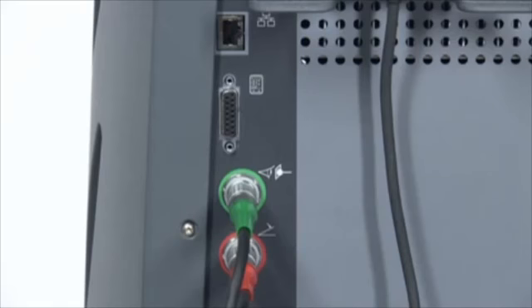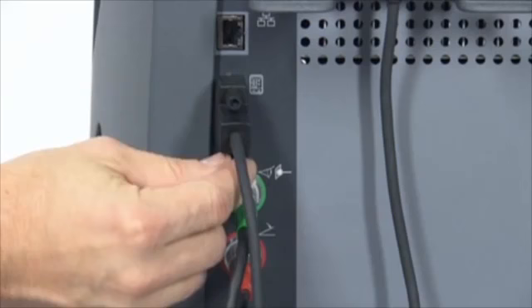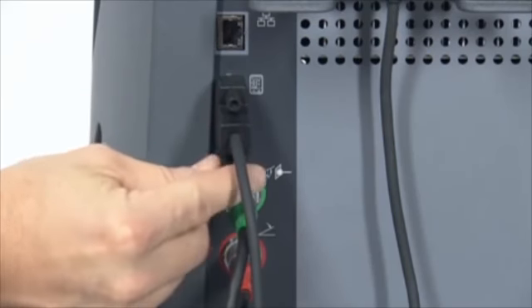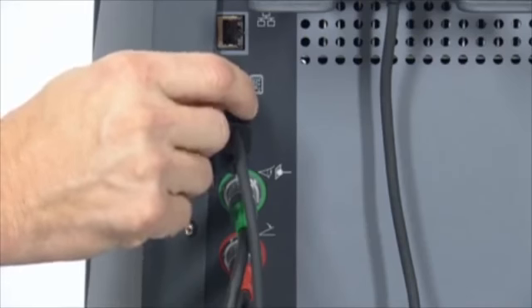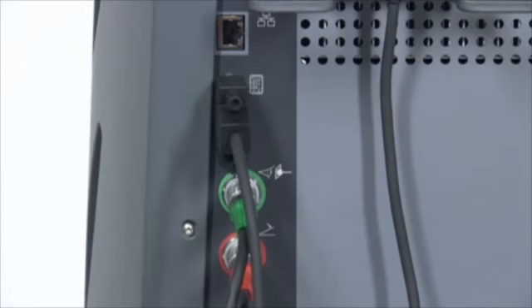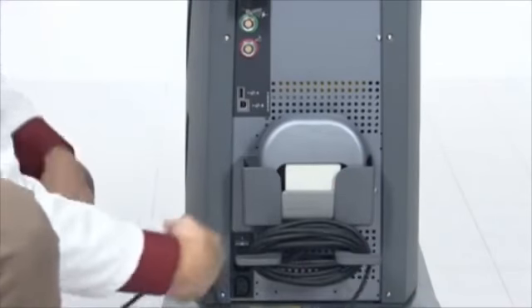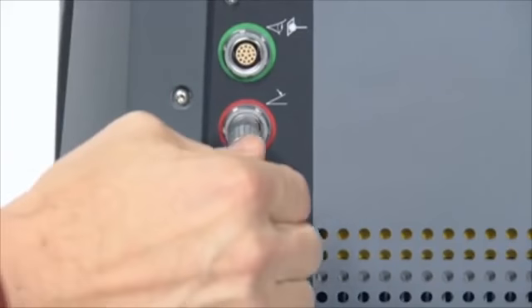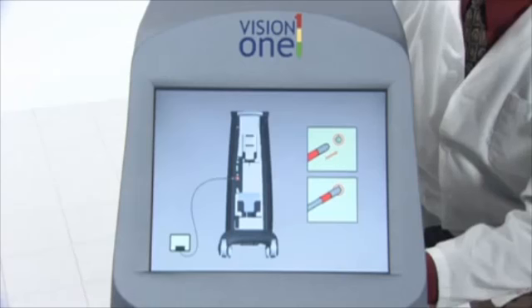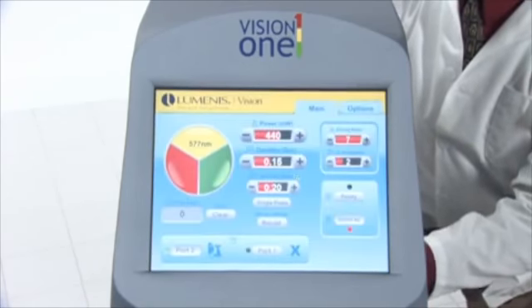Before connecting the laser components, inspect the individual components' cables and electrical connections for dirt, debris, or damage. Ensure the electrical cables are not frayed or split. Contact your local Lumenis representative if any component appears damaged. Insert the foot switch plug into the foot switch receptacle on the rear of the laser console. If the foot switch is not properly connected when the laser is turned on, this symbol displays in the control screen until the foot switch is properly connected.